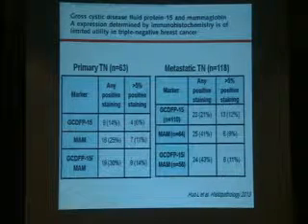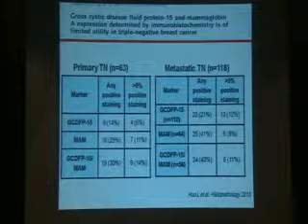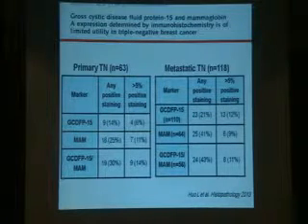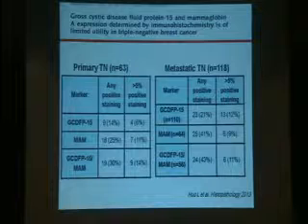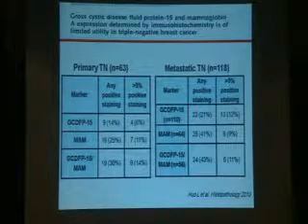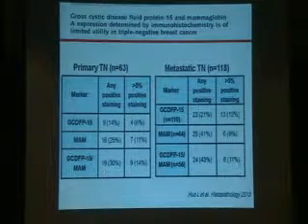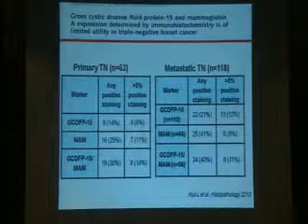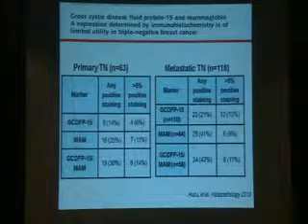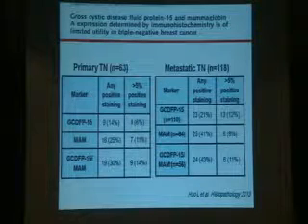One very important aspect of GATA3 is that it's a perfect marker for especially estrogen receptor positive tumors. But if you are dealing with triple negative carcinomas, either as a primary triple negative carcinoma or metastatic triple negative carcinomas, the positivity can be very focal.